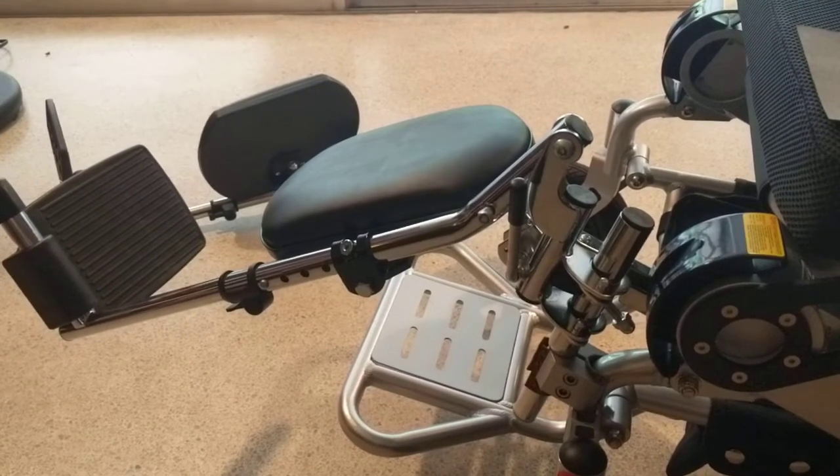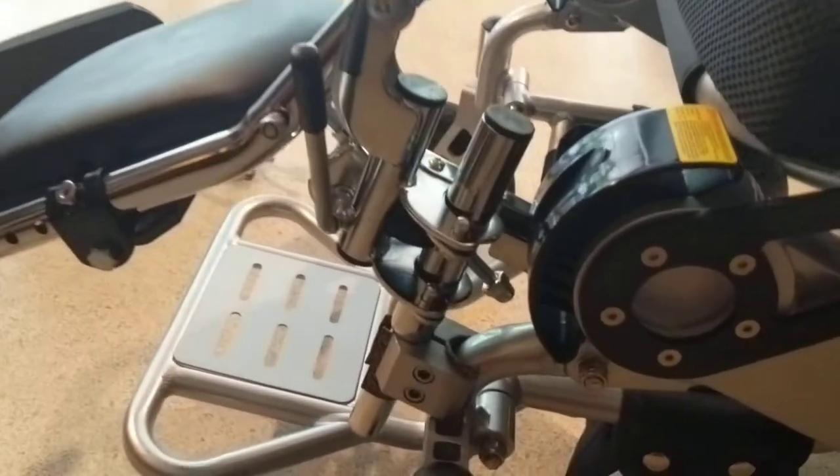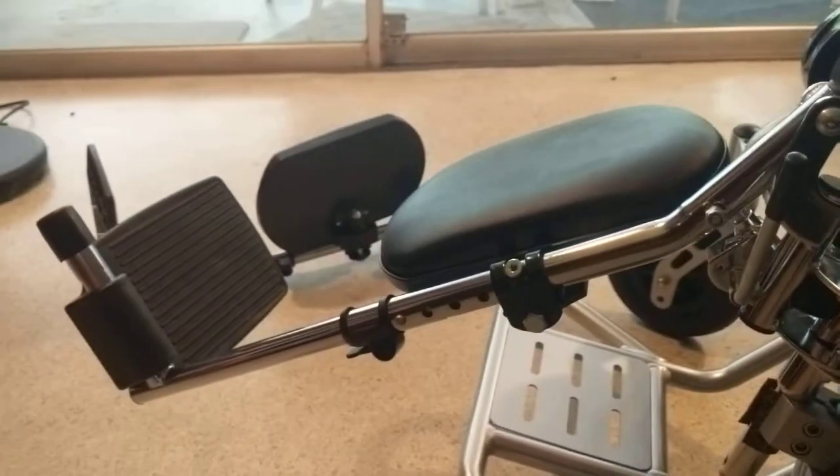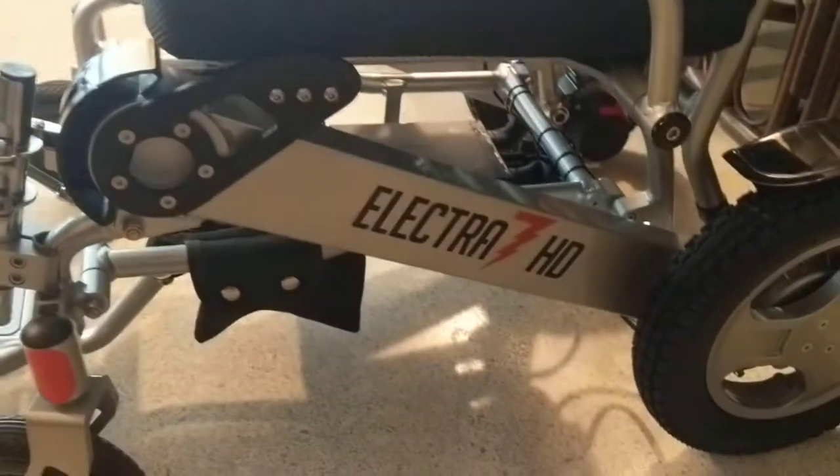Hello, this is Paul from Quicken Mobile. In the course of this video I'm going to show you how to attach the leg rest apparatus to either the Air Hawk, the Electra 7, or the Eagle.